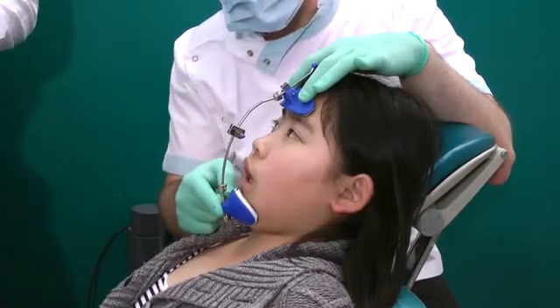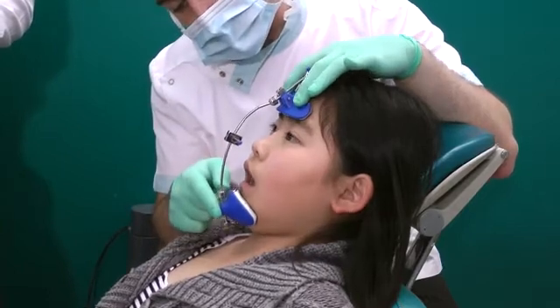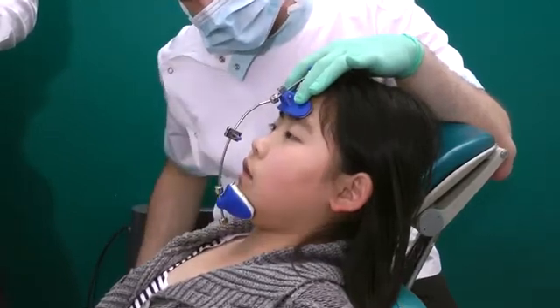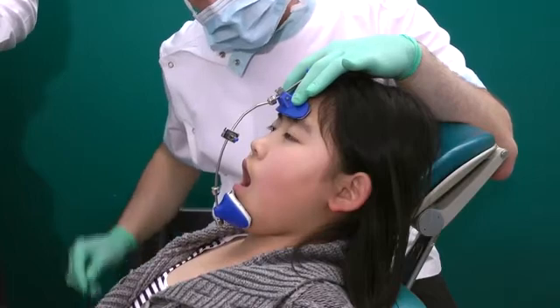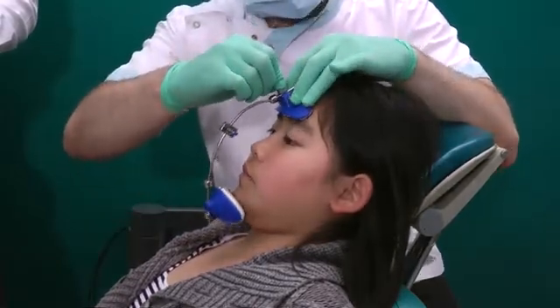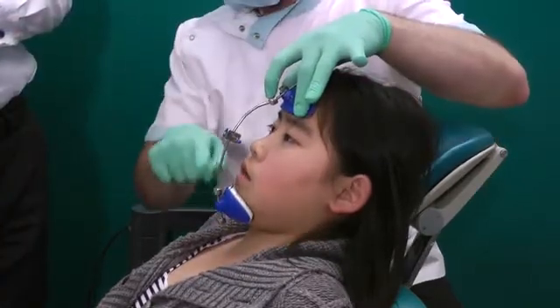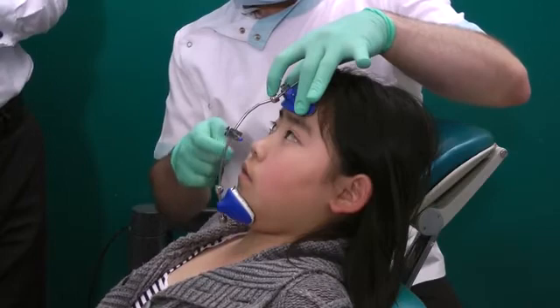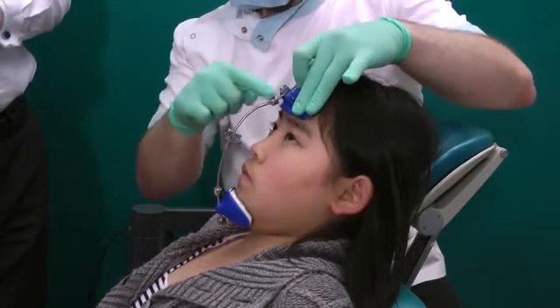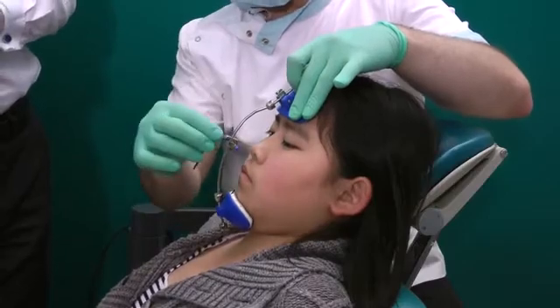We ask the patient to open and close while fitting and tightening the adjustments — open, close, open, close — making sure everything is secure. We do the middle bow last.